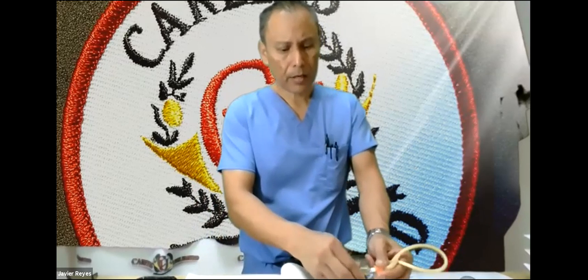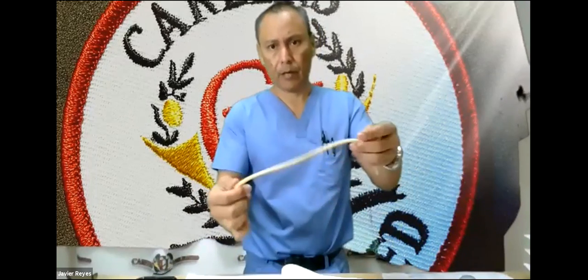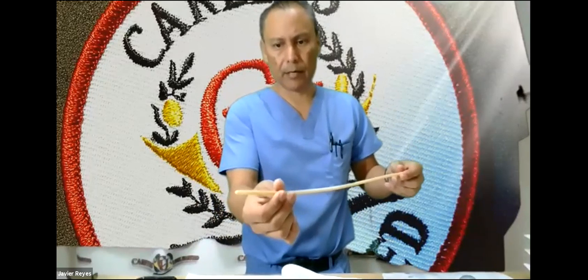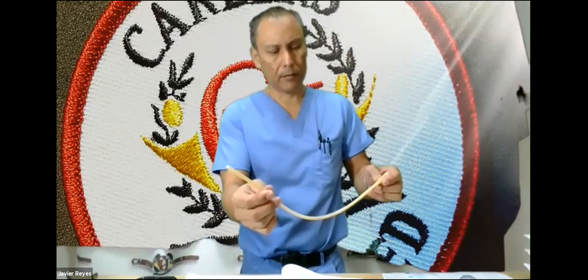So the catheters themselves are made out of rubber, okay? They're made out of rubber, you can see. So we have to ask for allergies to latex. A lot of these are latex free now, but we still ask, all right?